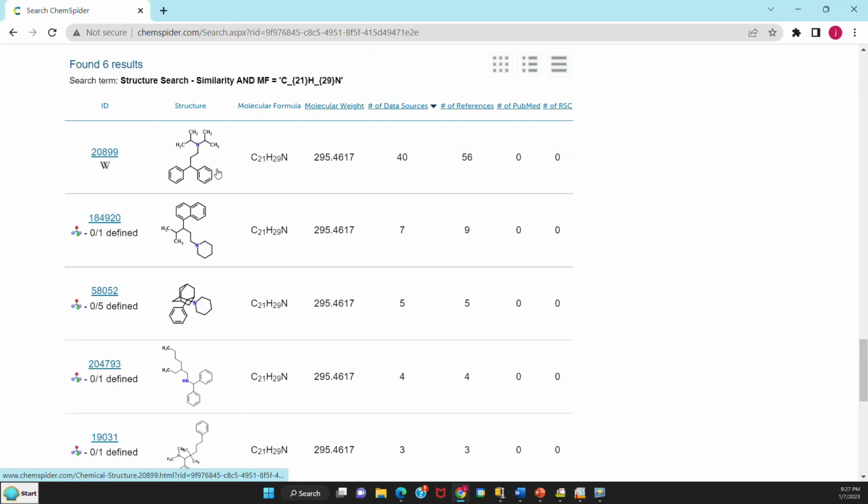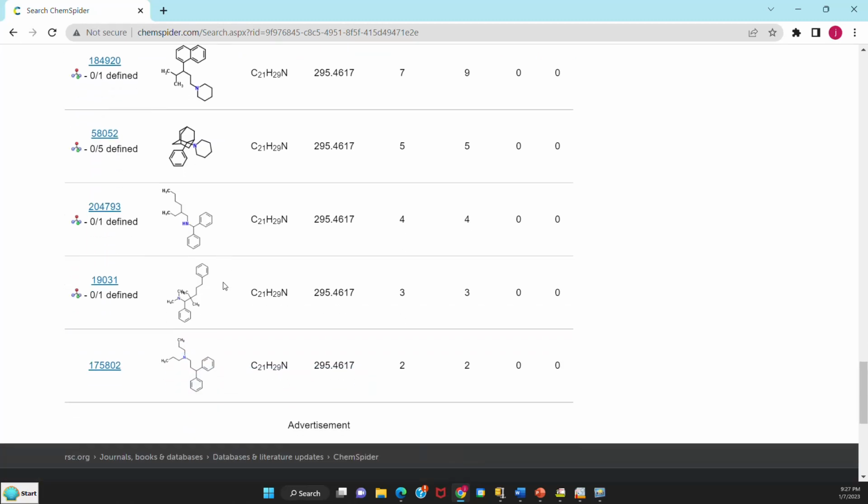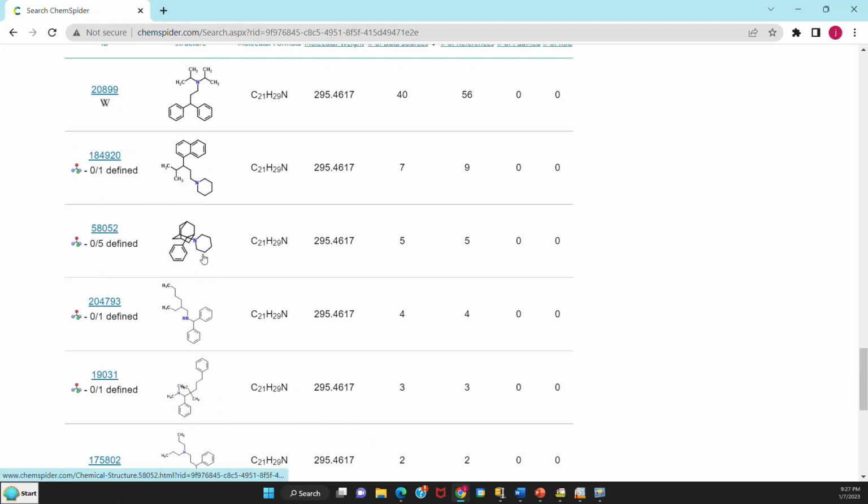If you start looking through these, again, the substructure we're looking for is the 2 rings with something between them. And there's really only one there, and again, it's the compound that we wanted. So I've shown you several ways to do this. You could even do this with the nominal molecular weight. I'll go back and try that just for completeness and show it in the next time segment.